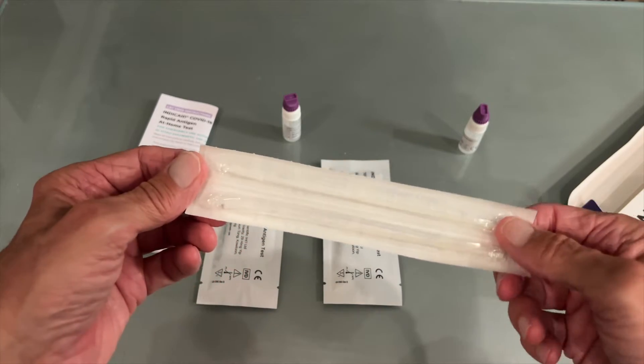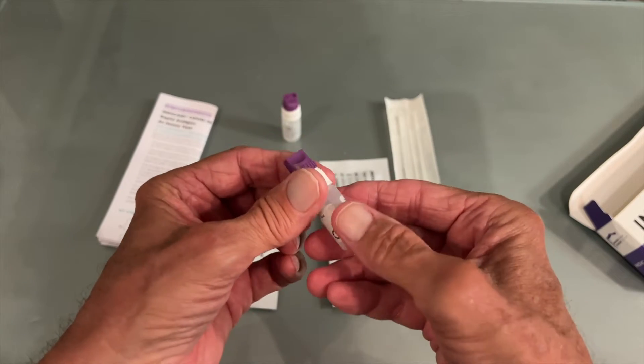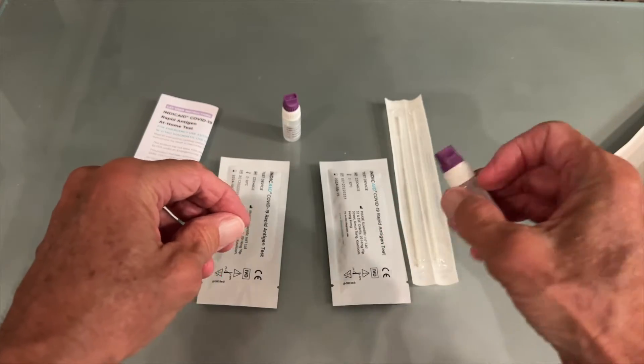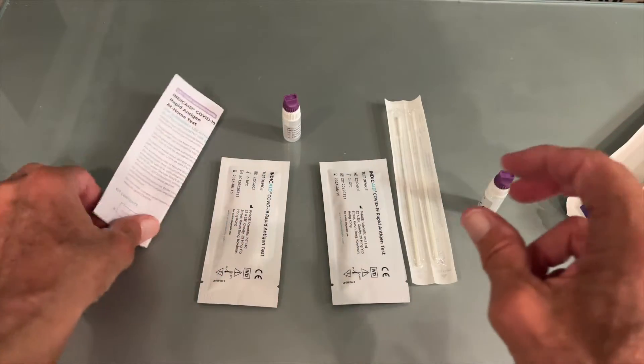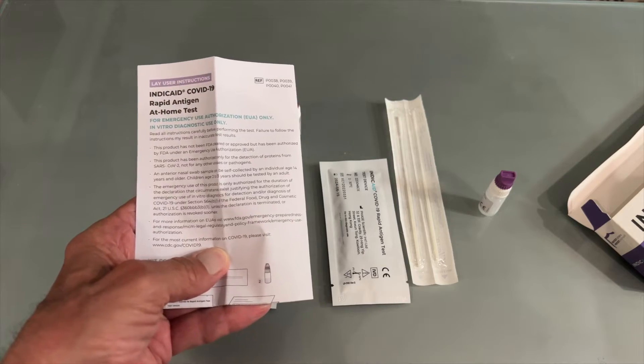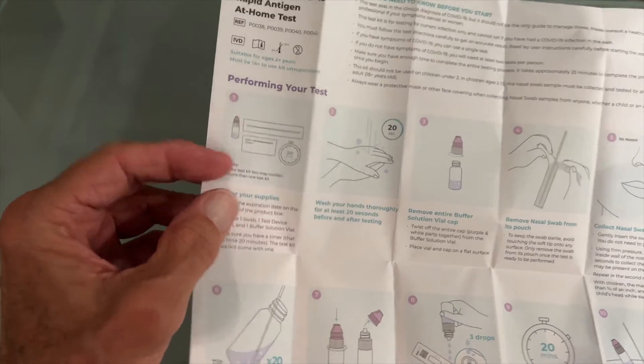Then you've got to stick it in here, smoosh it around, and then squirt it in there and wait. That's what I believe is the way we're going to do it, but I'm going to check the instructions first and see what they say.